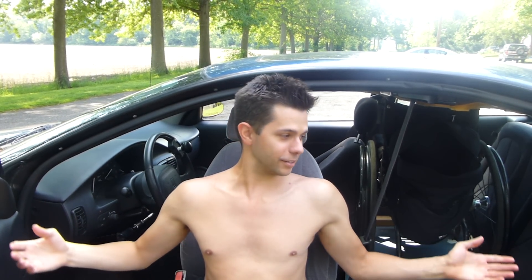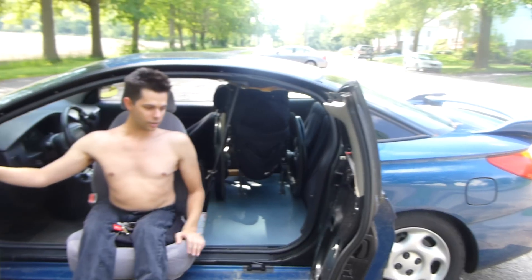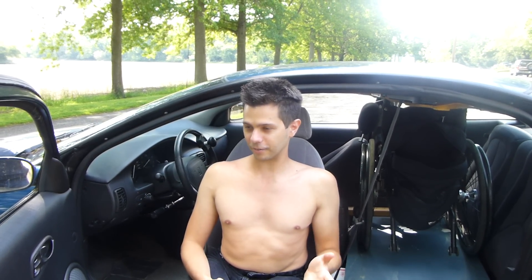This is my car again. I don't know how many of you remember, but this was the first video I did showcasing my car and the door and how I get the chair in and everything. I also did a video about my van, however I have not done a video talking about the hand controls that I use to drive, so I'm going to do that now.